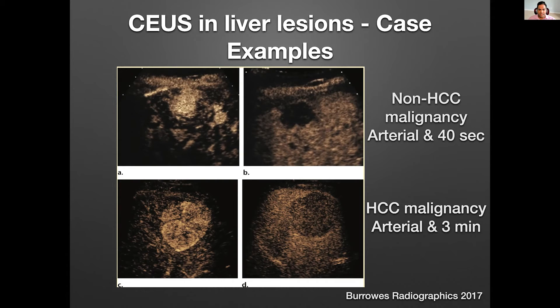Enhancement pretty avidly at arterial phase, but then at three minutes there's weak washout. So if you compare: punched-out fast washout at 40 seconds versus weak washout at three minutes — the weak, late washout is more the HCC pattern.